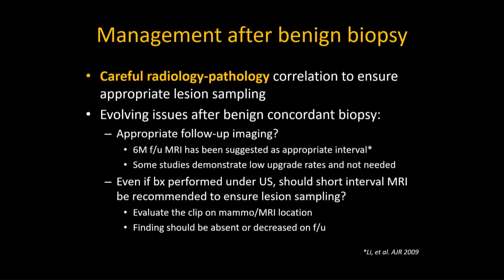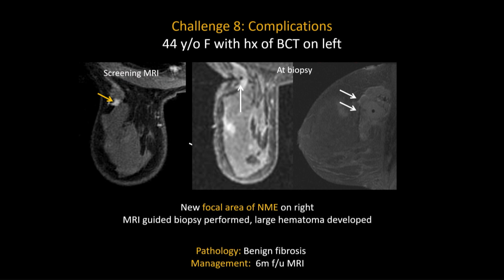What about for ultrasound? I didn't go over this in the talk, but if you do biopsy something under ultrasound, should short interval MRI be recommended? Again, I think that depends on your clip location. Do you think that the clip matches the finding that was seen on MRI? And you have to make sure that when you do the follow-up, that the finding is either absent or decreased. And this is a nice example of this.